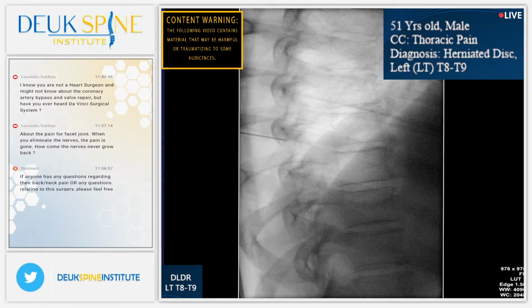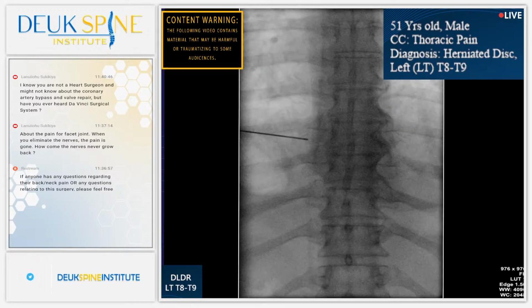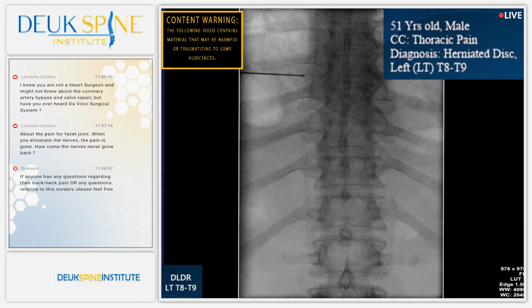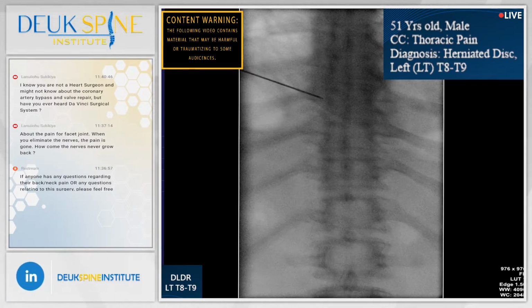Quickly. I think I'm hitting the TP. Be a little bit lower than that. Shot. That's too low. Give me a lateral view.